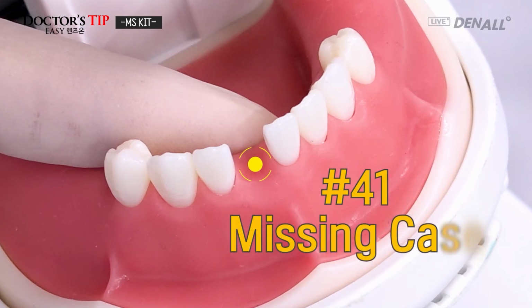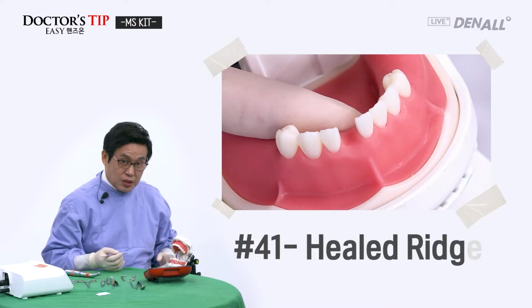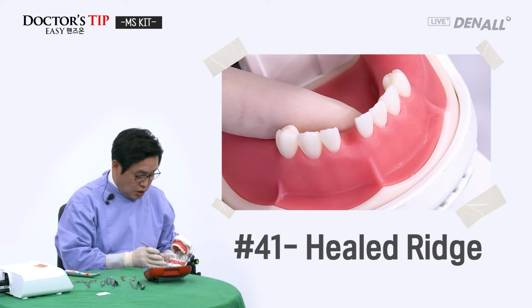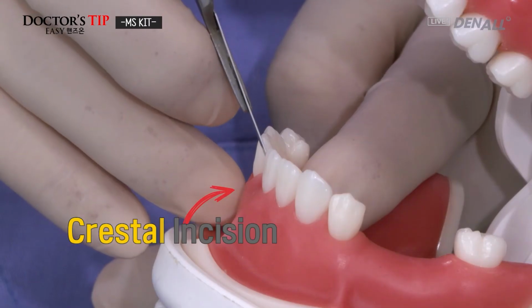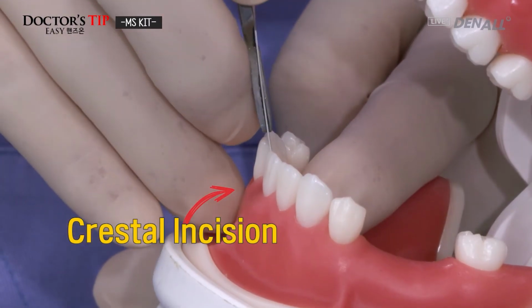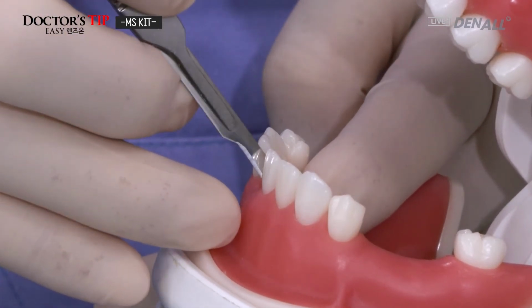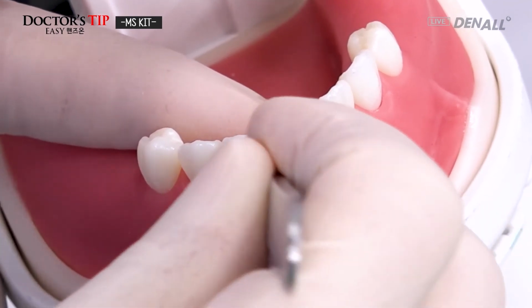41 is missing, and the 2.5 by 11 millimeter MS will be placed first in the missing area. It's been a while since the tooth was taken out, so it's a healed ridge. So I'll do a crestal incision toward the lingual side. To the adjacent teeth, I will release and open the flap.